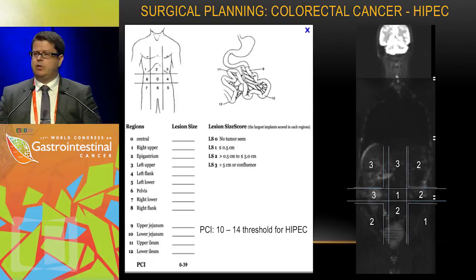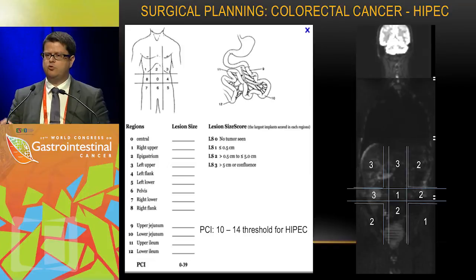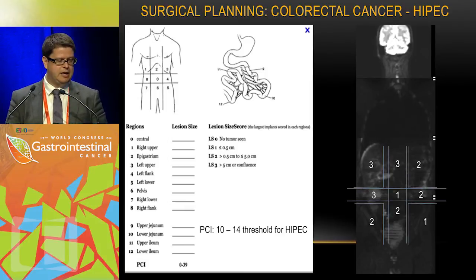And these are things that we then, as radiologists, have to learn from the surgeon. We have to talk very often with the surgeon, learn from them. How do you score it? Of course, you know the peritoneal cancer index. I didn't know it before I started with this technique. And very importantly, we will just do the same on the MRI like they will do with their laparoscopy.